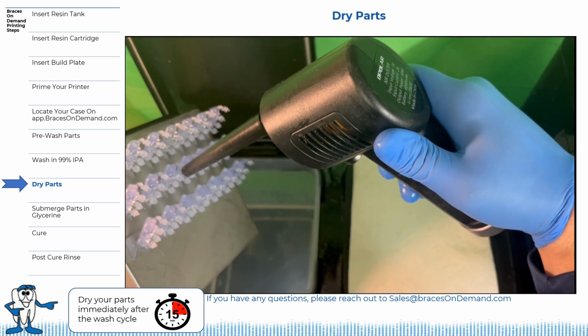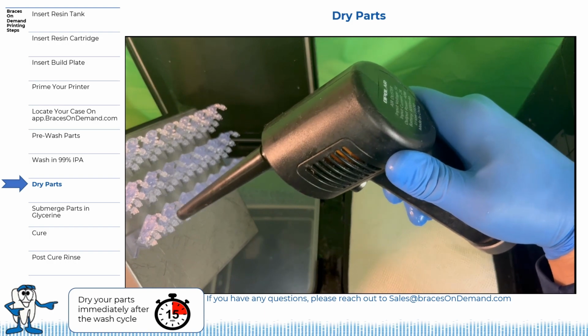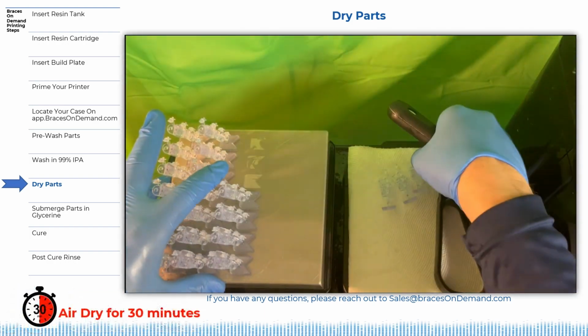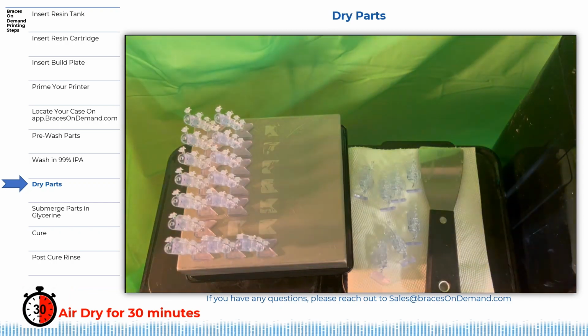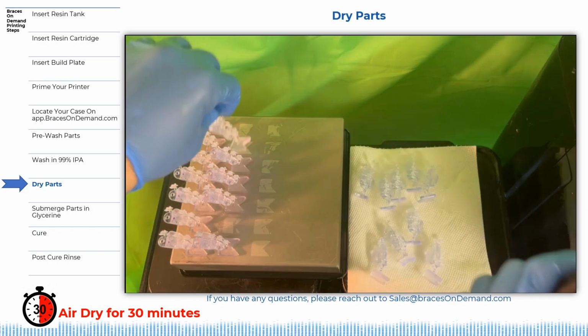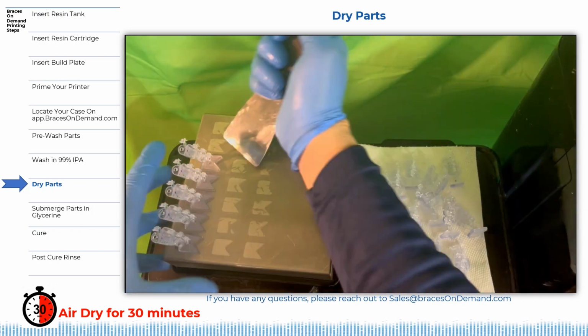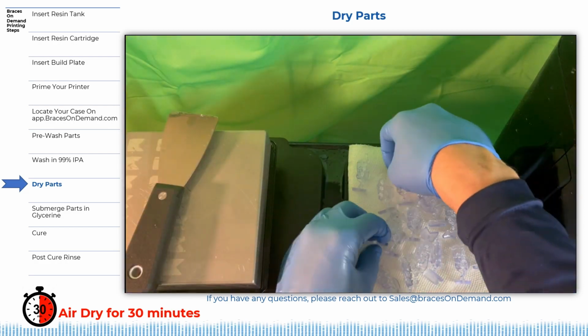Dried parts are critical when curing in vegetable glycerin to ensure parts don't stain during treatment. Using one of the two instruments provided in your Formlabs kit, remove your Braces on Demand parts. Before the parts are cured in vegetable glycerin, it is absolutely critical that the parts are completely dry. Place the parts on a clean surface and air dry for 30 minutes.